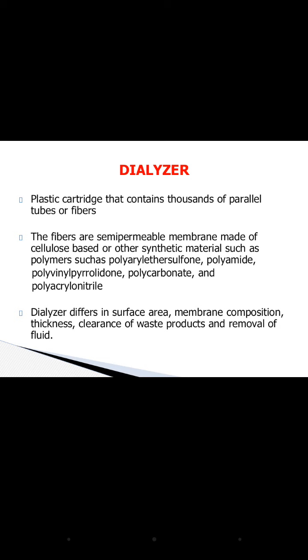So for one person, if the person is coming for the conventional hemodialysis, meaning every alternate day the person is coming to the hemodialysis machine, a dialyser is fixed for that person, and the same dialyser will be used for that person. So basically one dialyser is most commonly used for approximately 3 sessions. It is because the chances of getting bloodborne infections, like HIV, hepatitis B, C, will be reduced. So that's why the same dialyser is used, which can be reused for 2 more sessions.